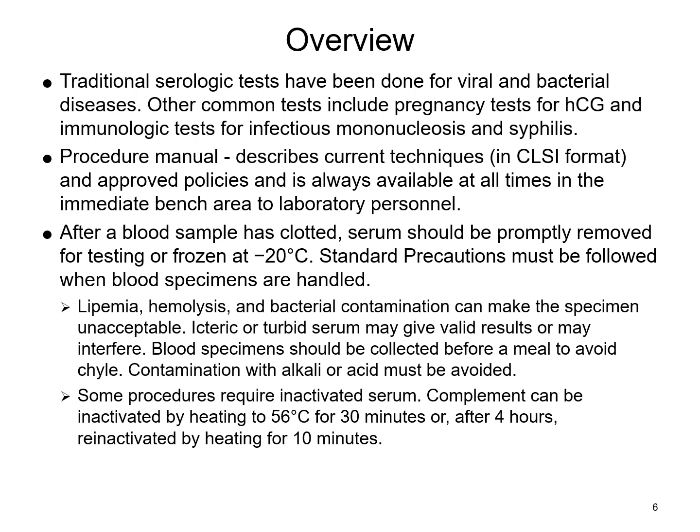For example, some tests may have interference from turbidity. So it's best to have a fasting patient, because if you collect that sample shortly after a meal, you will start to see chylomicrons, which are fat globules that appear in serum after a patient has eaten. That will cause turbidity, which might interfere with the test method.